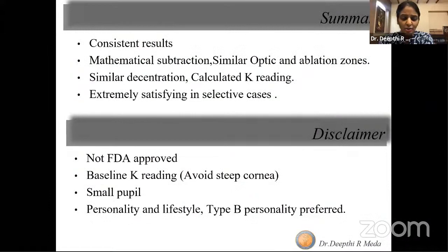So we have had around, I think, 8 cases now, and we have had quite good, consistent results. All of the 8 are extremely satisfied. And a big disclaimer would be these sort of treatments are not FDA approved, nor approved by your machine. So the onus is on us. So case selection is extremely important.